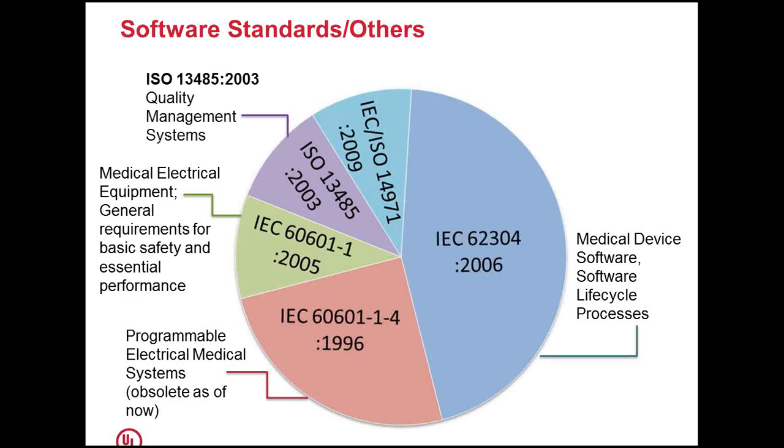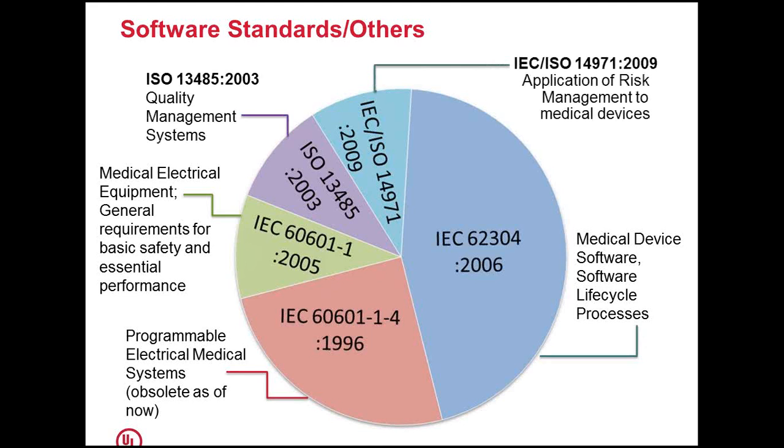13485-2003 is the quality management system standard, and 14971 is the risk management standard. So while developing software for medical devices, we need to consider the requirements from all these standards, and integrate the process within the quality system so that the resultant product, medical device software, is compliant to these standards.